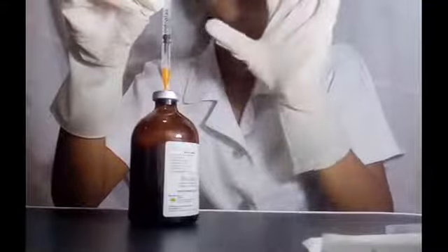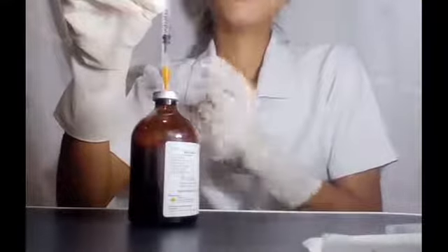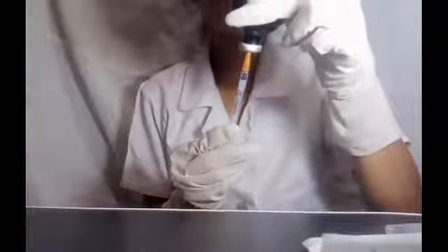And then we're going to flip it upside down and pull back 0.3. The best way is to do this at eye level so I can see it and make sure we're at the right place.